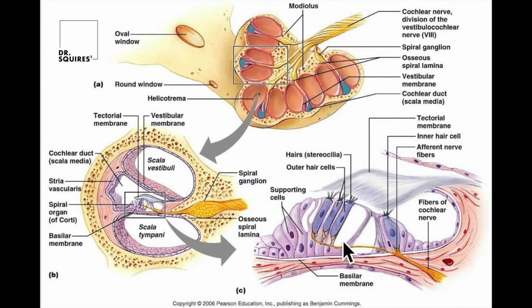So we're measuring different points along the cochlea that are associated with different frequencies. So we'll measure anywhere from about 1500 hertz all the way up to about 8,000 hertz and sometimes beyond that with a distortion product otoacoustic emission. So as the sound comes in, these little guys act like an amplifier, and these cells will extend and push that tectorial membrane up and down so that the inner hair cell, which is located right here, can do its job in transmitting the large majority of the hearing to the brain.